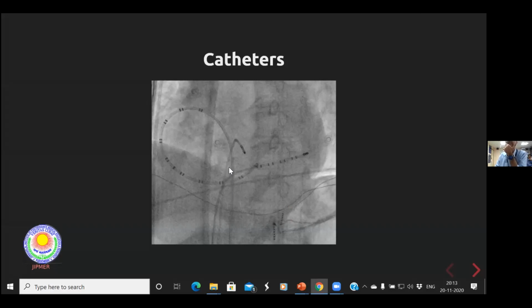So what we do is sort of hybrid. While testing pre and post ablation, we keep the catheter across the isthmus. But while ablating itself, you can pull the catheter back and keep this lateral to the isthmus.